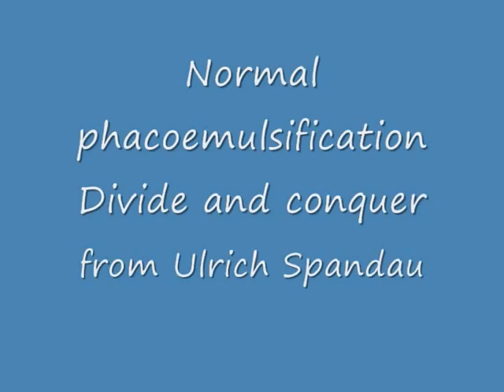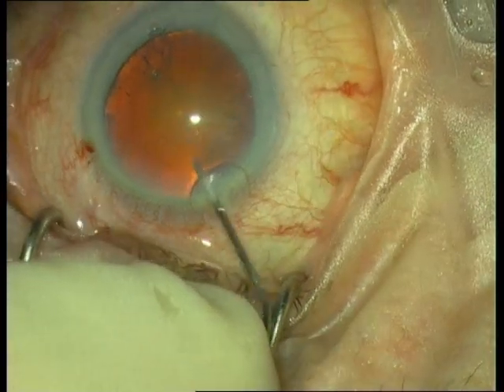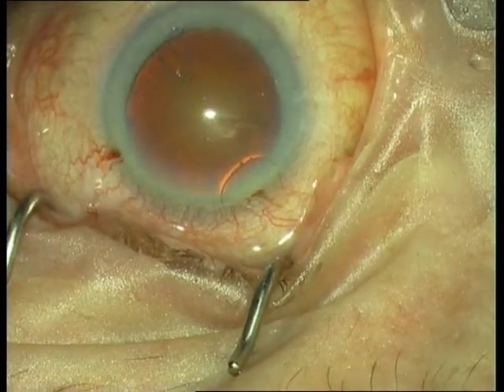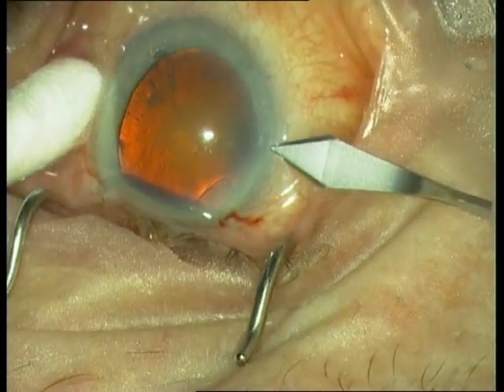I will present a normal phacoemulsification, present paracentesis at 2 and 10 o'clock, injection of viscoelastica, and tunnel incision at 9 o'clock.